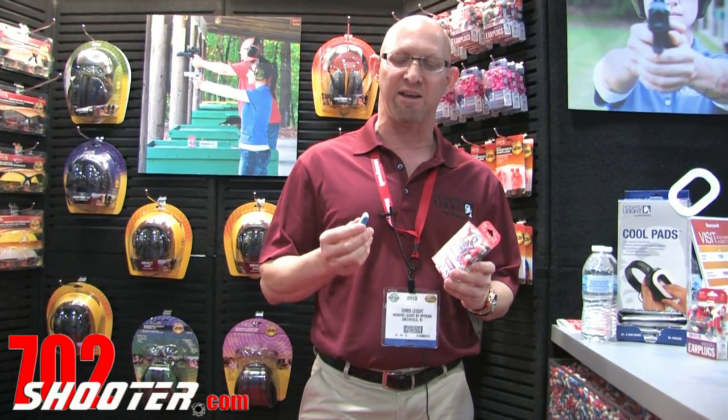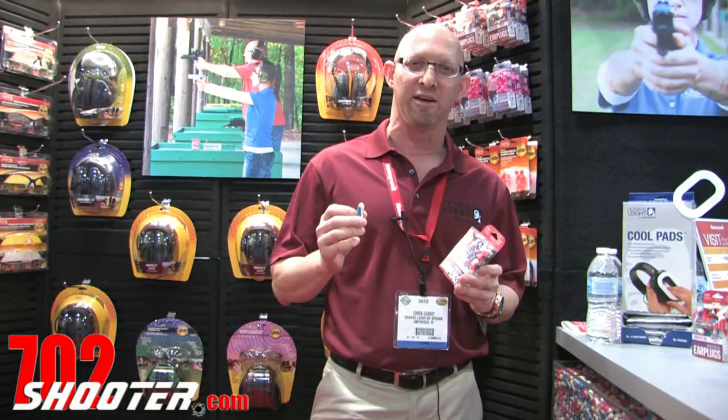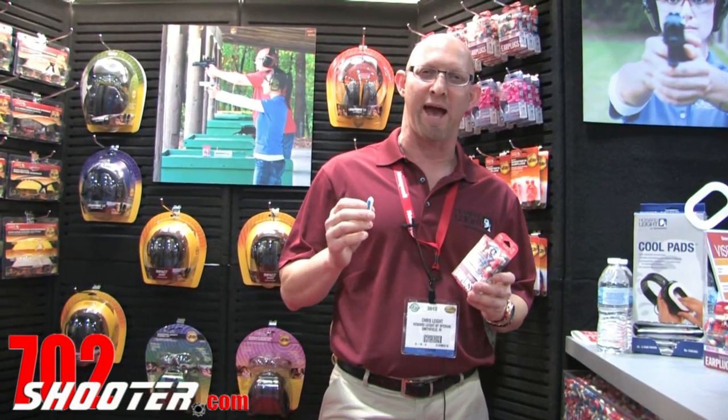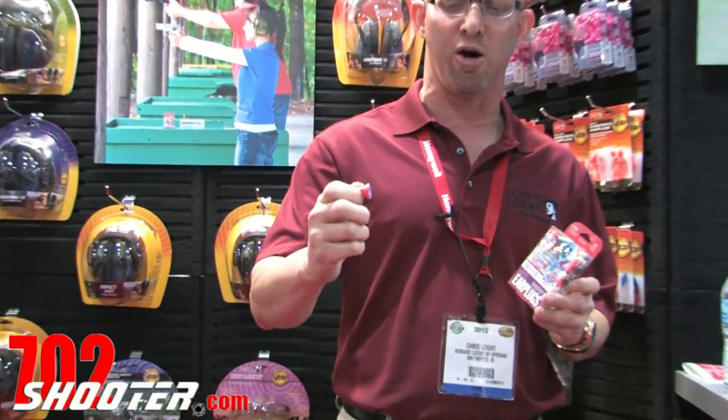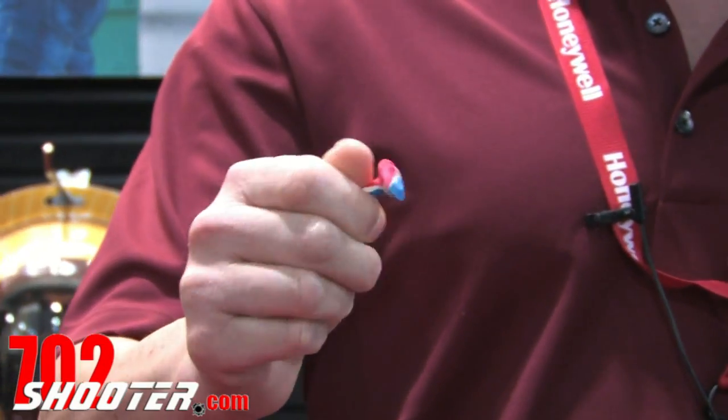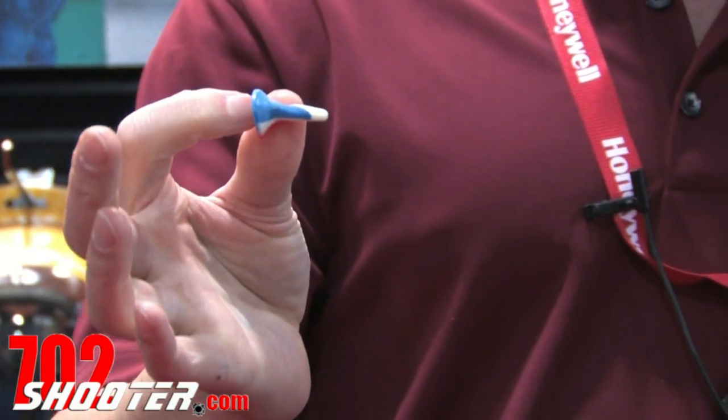Hi, I'm Chris Light with Howard Leight Hearing Protection, here to talk to you about the new Super Leight USA earplug. We're very excited about it. It is a three-color earplug with a patent and trademark on the colors. It's a flanged earplug that you roll through a small, crease-free cylinder and insert into your ear.